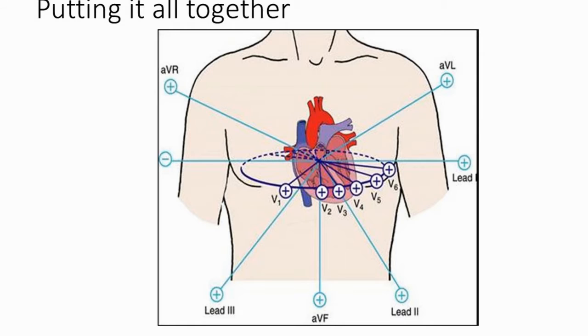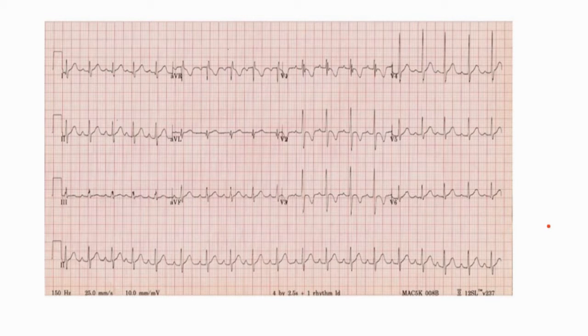It's hard to tell here in 3 dimensions, but that's looking at the heart from the anterior-superior, inferior-superior, and right and left standpoint. And the precordial leads here in the dark blue look at the heart from the anterior-posterior and right and left standpoint. And that essentially makes up the 12, or in pediatrics 15, lead EKG.